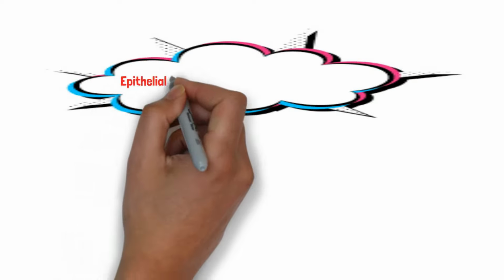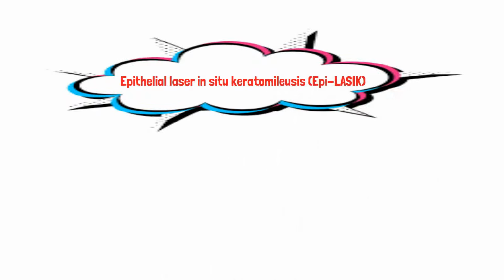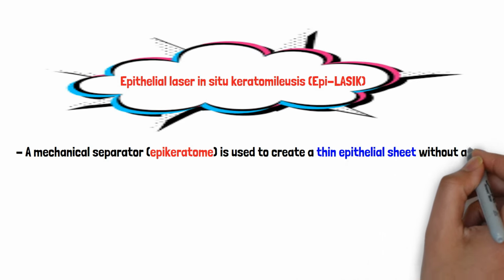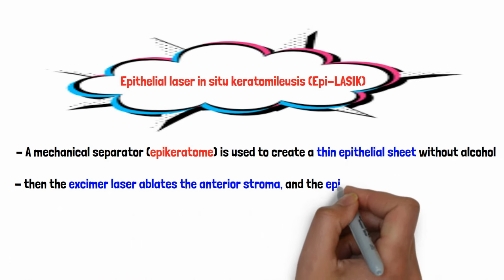A refinement of this approach is EpiLASIK, which avoids the use of alcohol altogether. Instead, a mechanical separator called an epikeratome is used to gently lift a thin epithelial sheet. After stromal ablation, the epithelium is carefully replaced, promoting smoother healing and minimizing haze formation.